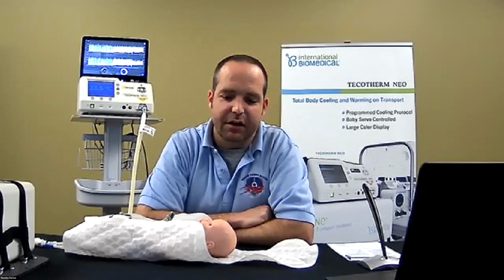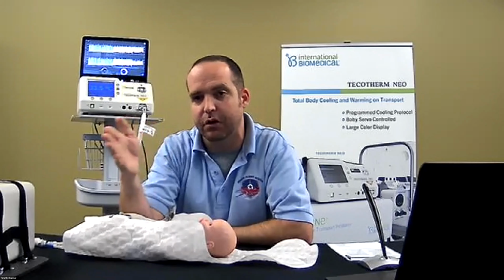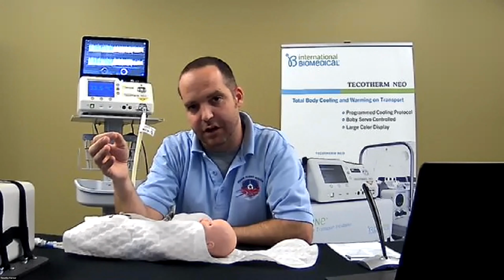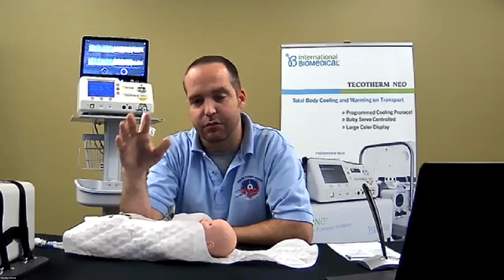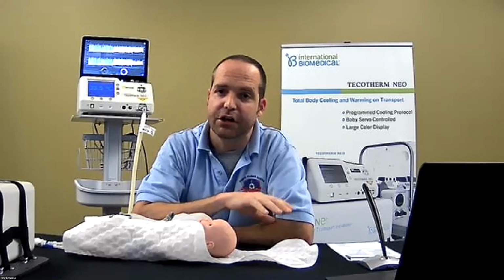As far as the interface and prepping it, it's very simple. Behind me, you have it in constant mattress mode. When we're in the servo control mode, when targeting therapeutic hypothermia, it'll be green. And if it goes out 0.5 greater, plus or minus, it'll alarm at you. So feedback from the team is if the rectal probe gets dislodged, it's very quick to tell us something's gone outside of parameters for us to troubleshoot, which is very important, especially when you're dealing with a very critically ill infant, trying to get them to a higher level of care.